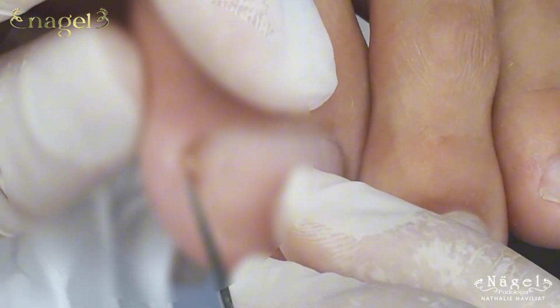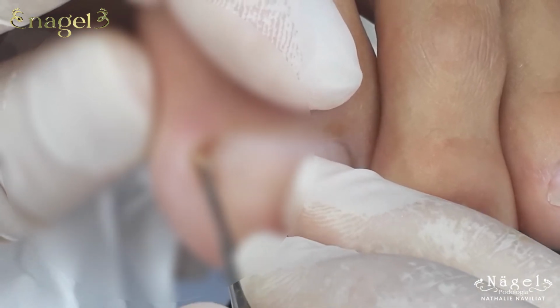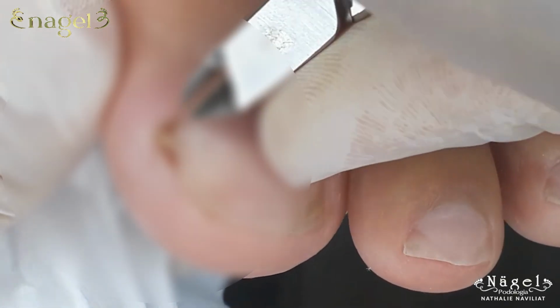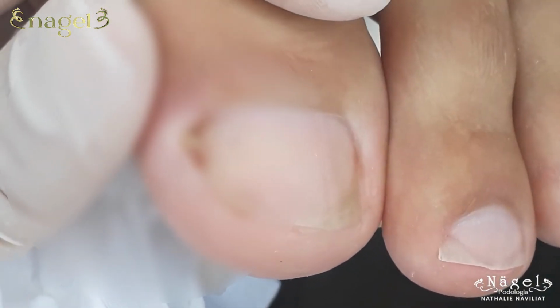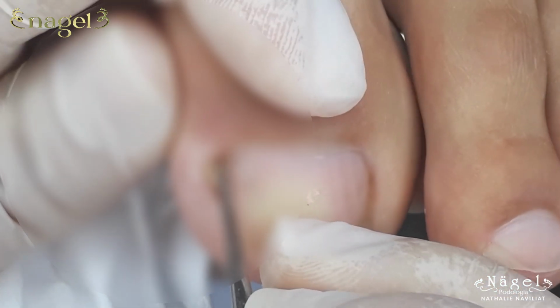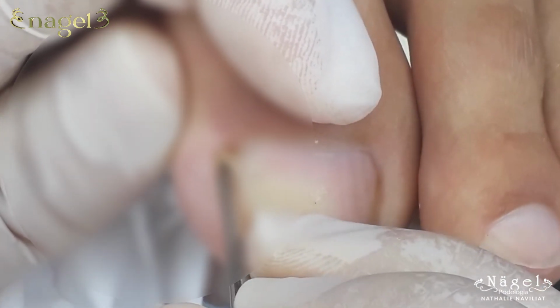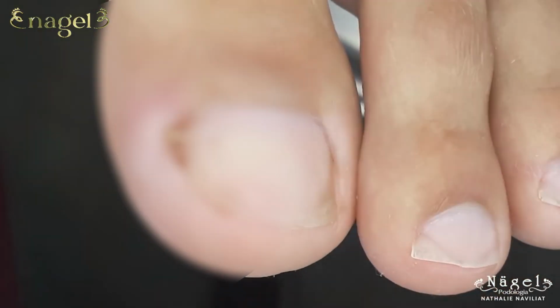Using the podiatric nail clipper, I say, this edge looks good, but since the nail is already a bit rounded, I can't make it 100% straight. I'm trimming it as straight as I can with the podiatric nail clipper, but we might need another procedure in the future to avoid issues. I keep a safe length, which my patient has maintained well, and reinforce. This length is perfect. Let's keep it this way.